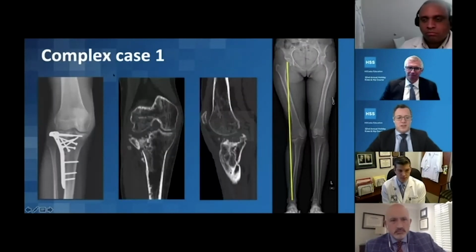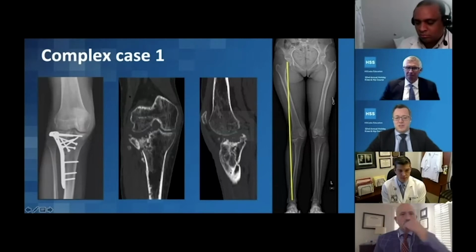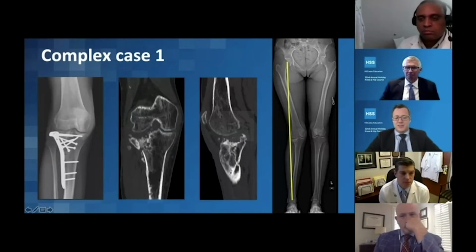I went ahead, we took out the plate and screws first. We did it in a staged fashion. She had no problems healing that other incision. We took some bone biopsies just because we were there. So no evidence of infection at all, and her ESR and CRP were completely normal on that. Got the CT scan, and it showed some defects. Really, it doesn't seem like it's that difficult to manage. Maybe a 2A defect, but overall it wasn't that bad.